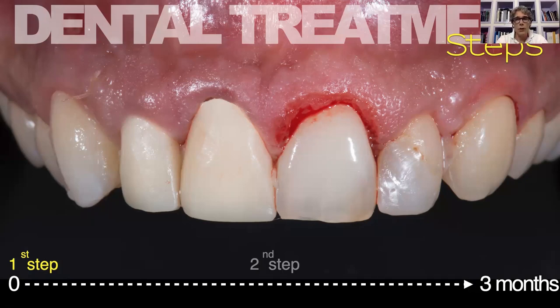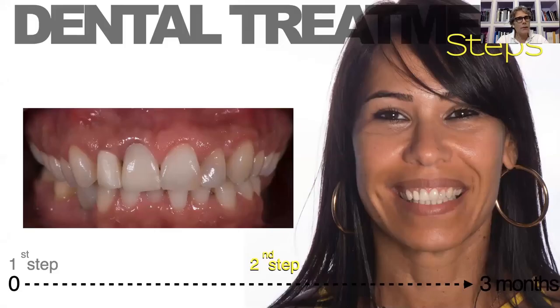Because I remind you that this patient was a gummy smile patient, and in a gummy smile patient, before finalizing the case by prosthesis, it is fundamental to balance the gingival margins of a couple of teeth in the front areas to each other. So after this gingival resection, after 3 months and obtaining a good maturation of the soft tissues around the temporaries and around the tooth 2.1, I was ready to finalize the case.